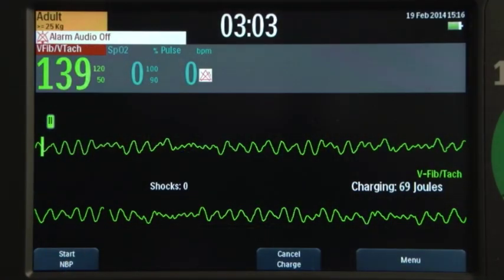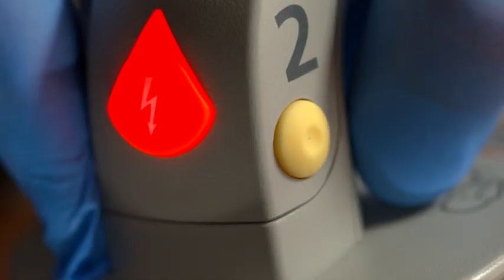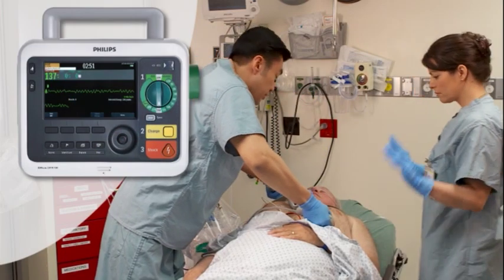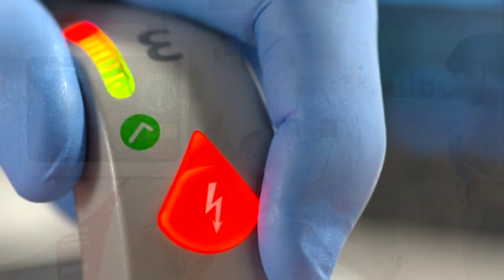Then press the charge button on the paddle. The orange shock buttons on the paddles flash to indicate the defibrillator is charged. Make sure no one is touching the patient or anything connected to the patient, then press both shock buttons simultaneously located on the paddles.